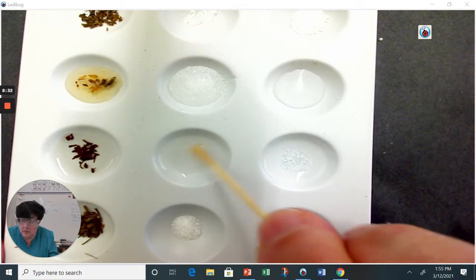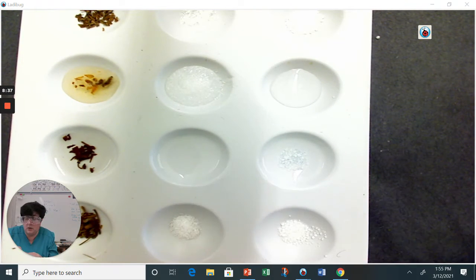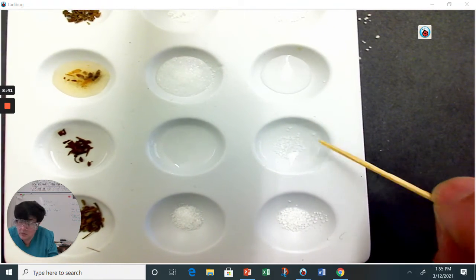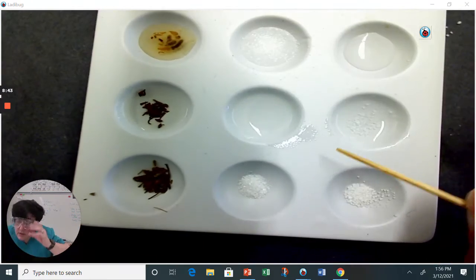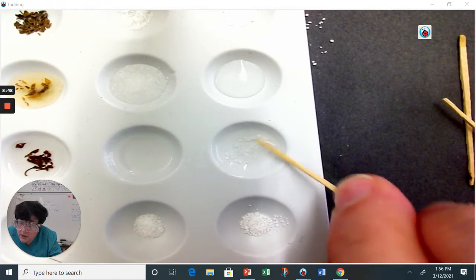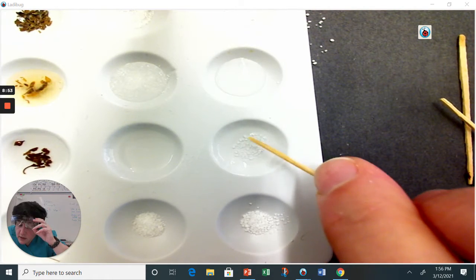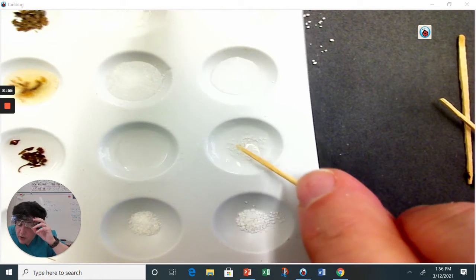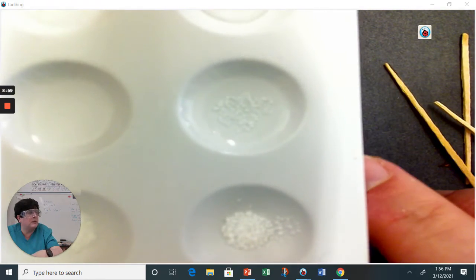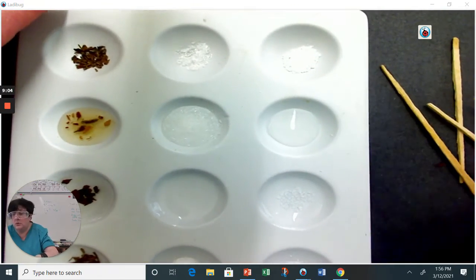Okay, now, if you look, nice, stir there. I don't see any more powder. Oh, that color changing? Scott should react with this if it is cocaine, and it's very faint. Oh my gosh, you can hardly see that. There is a tiny little blue color forming around the outside of the crystals. Bet you can't really see that. That's horrible. It's supposed to turn blue.